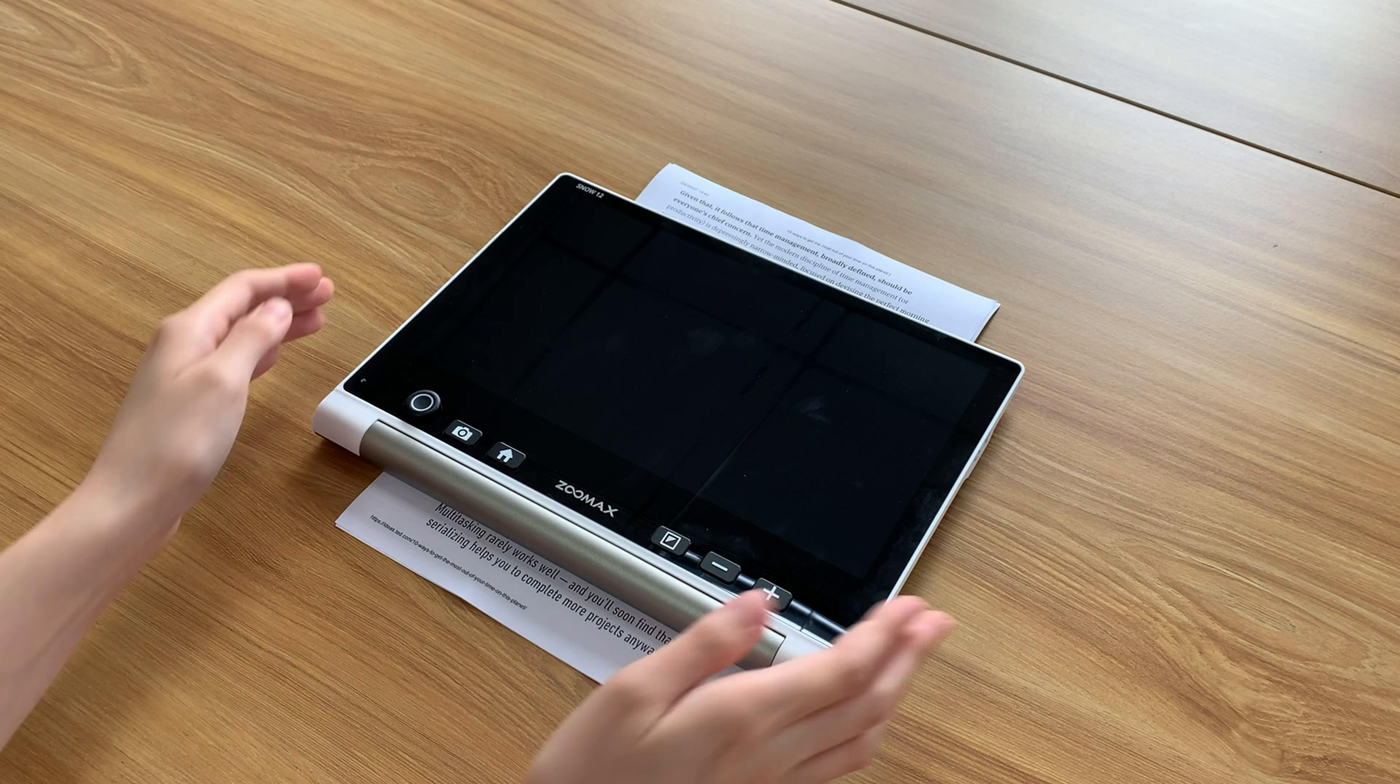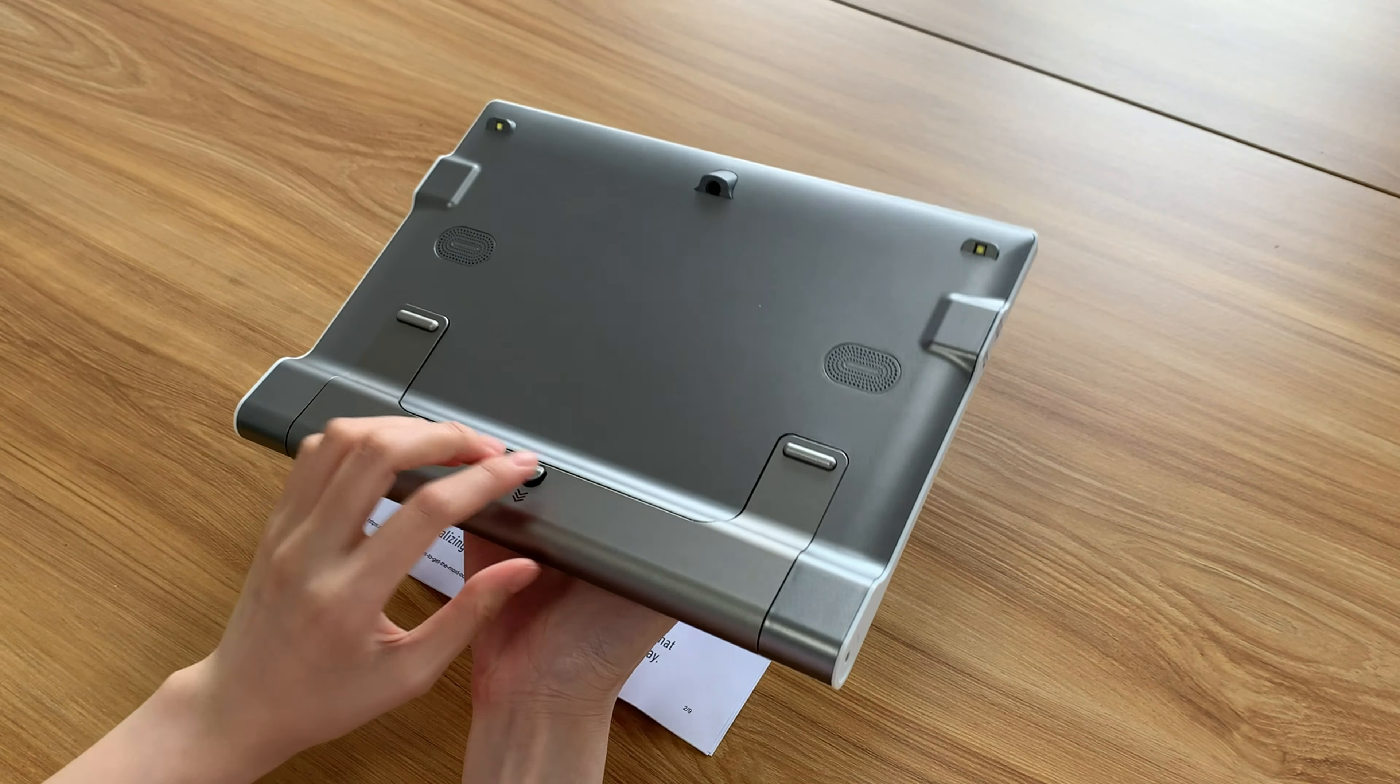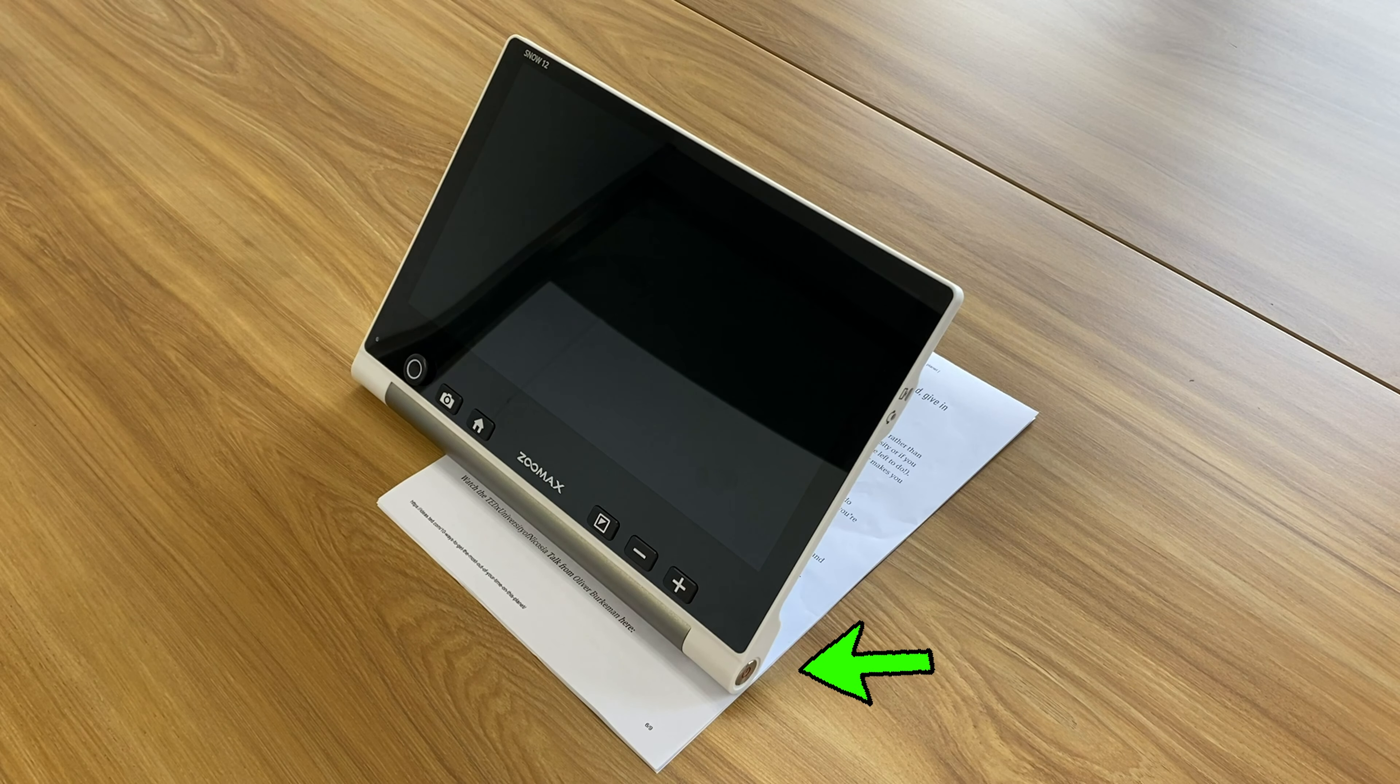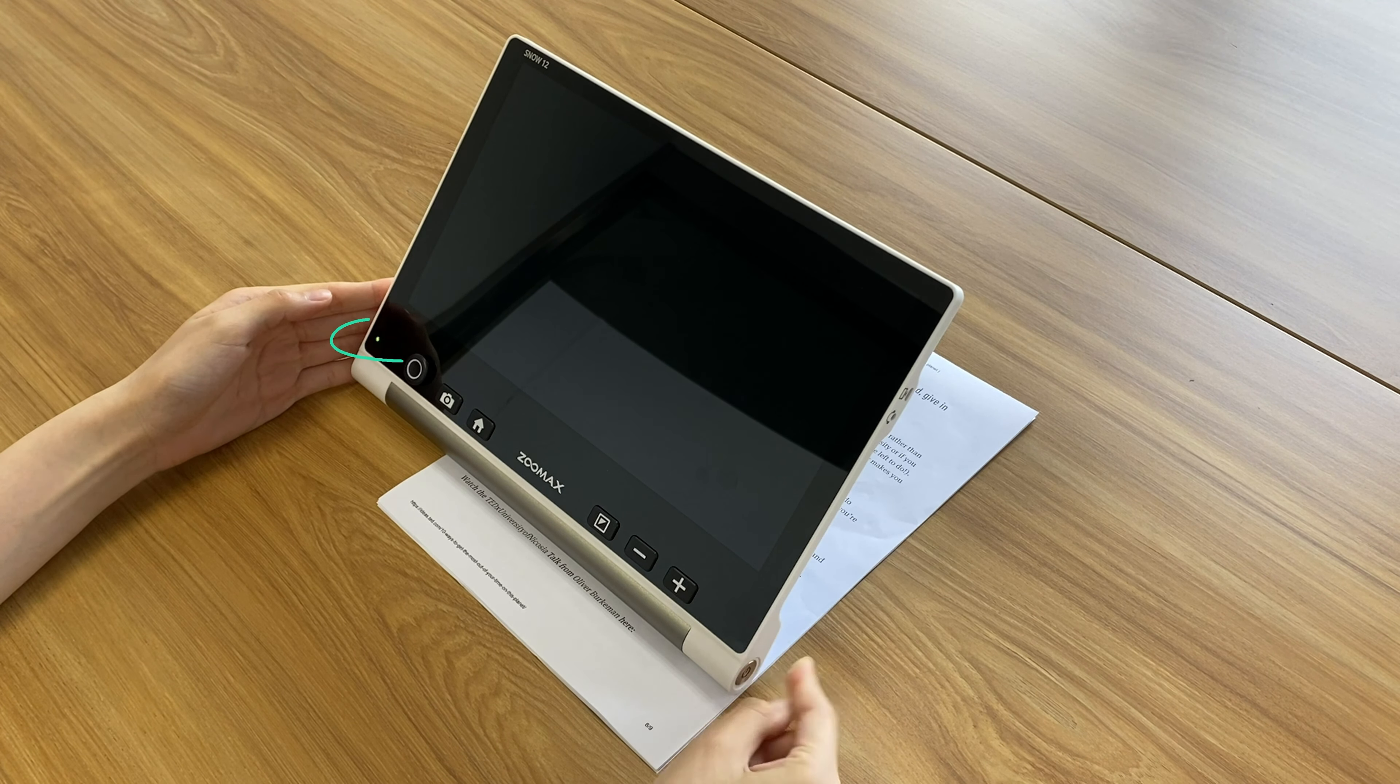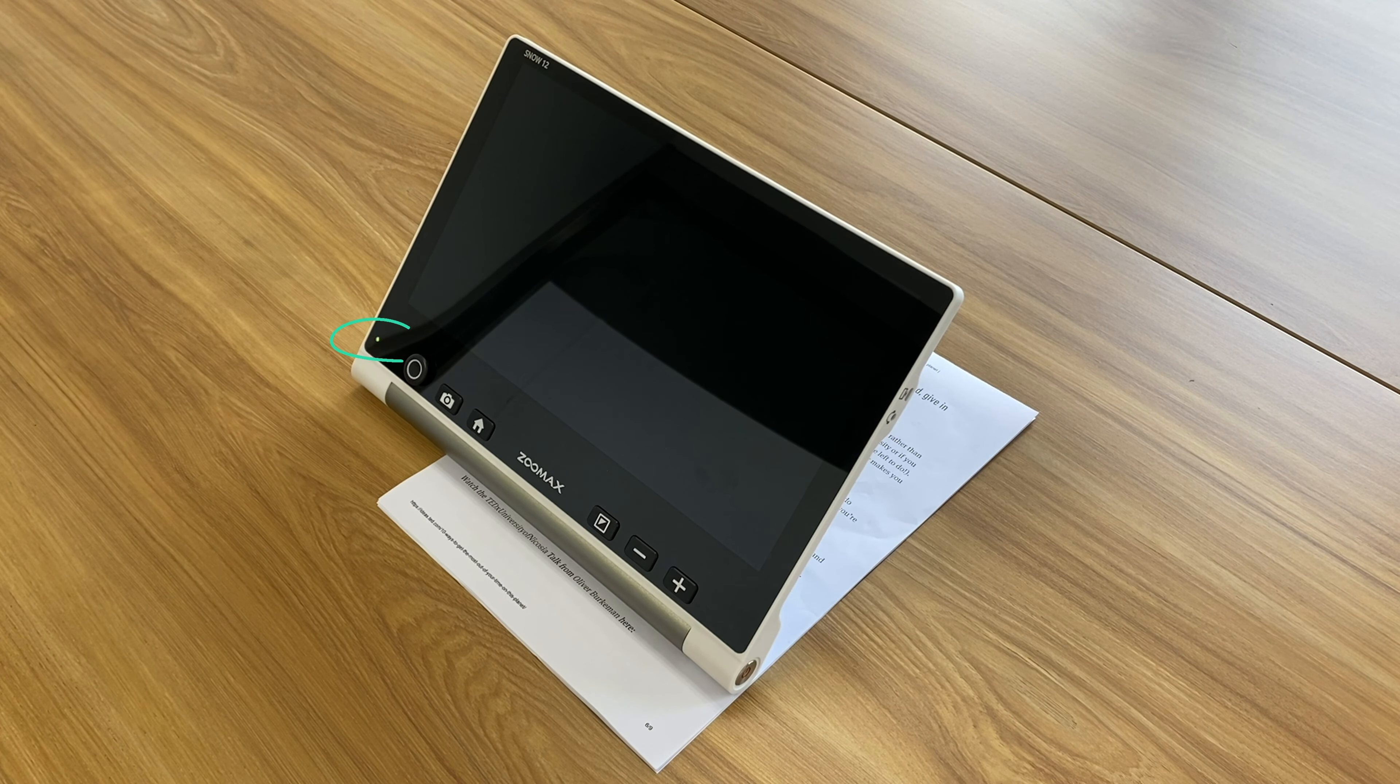Now, let's start with the physical buttons. Press the button on the back to release the footstand and put it on your reading materials. Hold the power button here for about three seconds and release it when you see the green indicator is on.